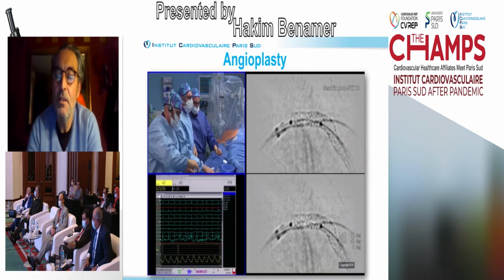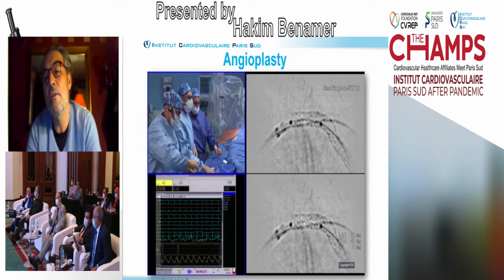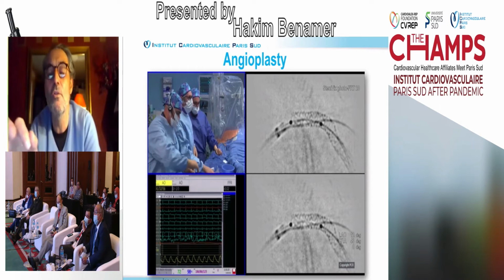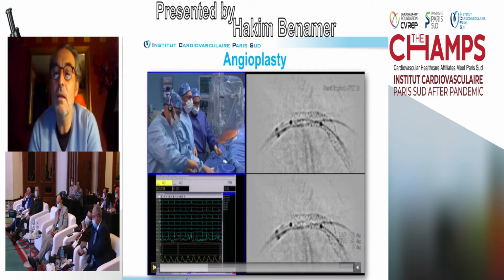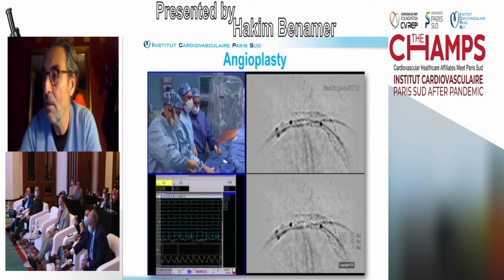So I think the last point is the usefulness of the stent to make a good POT, to cover the proximal part of the bifurcation without any protruding of the balloon and making a geographical miss. What size of the stent? The size of the stent was 3.5, and the 2.5 was the side branch. And the size of the left main on OCT was how much? It was 5.